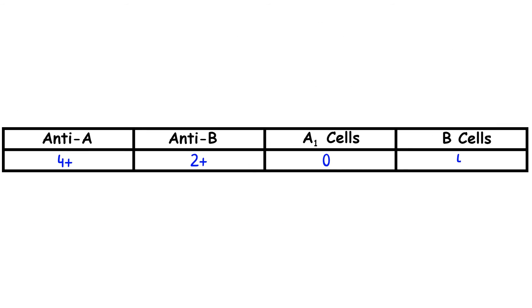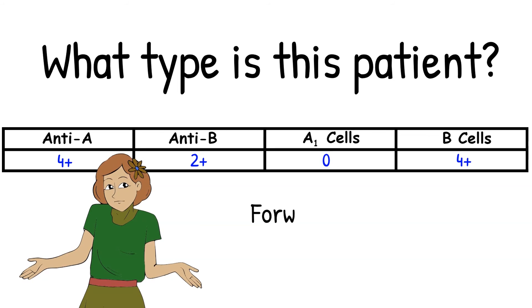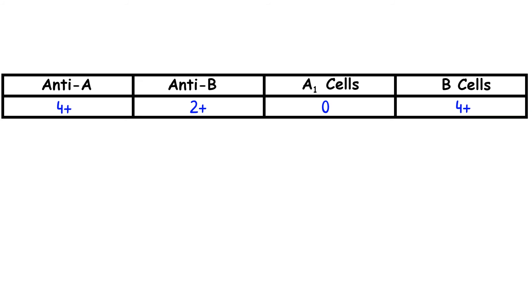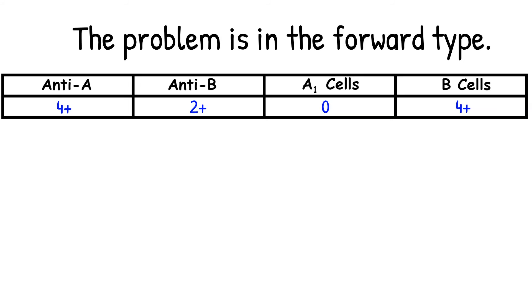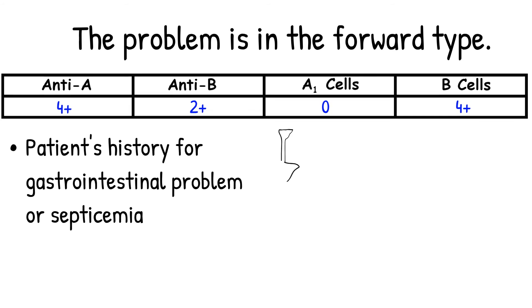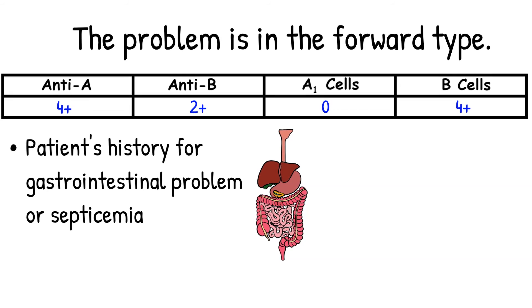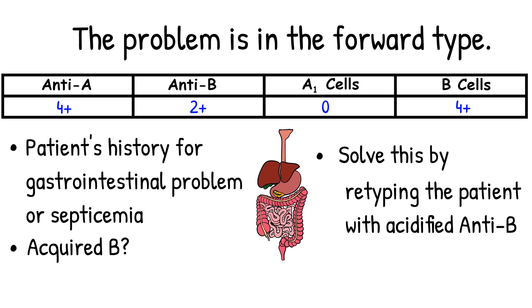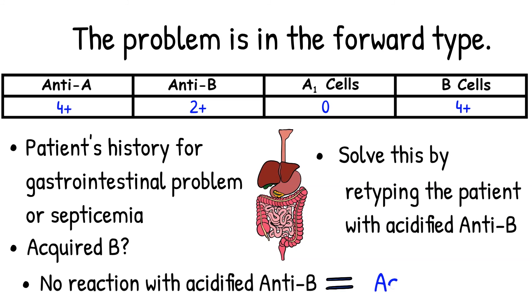One more example. What would you do if you see this type of reaction? The forward gives you type AB with a weak expression in anti-sera B, and the reverse gives you type A. Looking at these reactions, I would suspect that the problem is in the forward type — there is an unexpected reaction in anti-sera B. Here are the steps to solve the problem: check patient history for lower gastrointestinal problems or septicemia. If the patient has a history of lower gastrointestinal problems or septicemia, then it is possible that the patient has an acquired B. To solve this problem, repeat the forward typing in an acidic environment. Acquired B in an acidic environment only reacts with a true group B person.